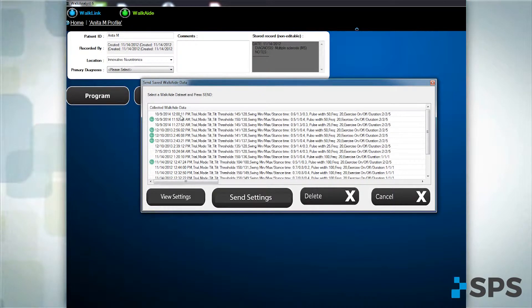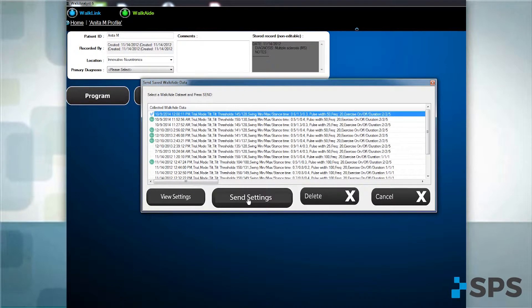Identify the program that you wish to transfer to the patient's device. Click on that item and click Send Settings.